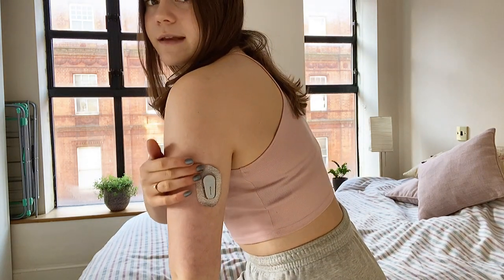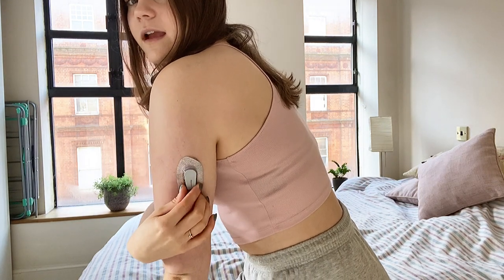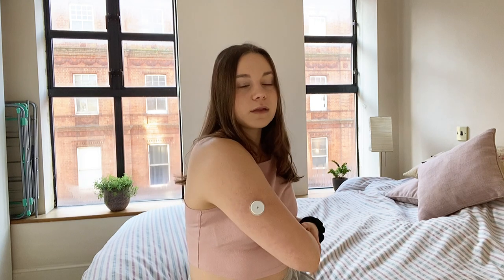One thing to note is that the Dexcom does look slightly more medical — you've got the whole device plus tape, and it sticks out a tiny bit more; the actual site is bigger compared to the Libre, which is smaller and in my opinion doesn't look as medical. Personally I don't care what my devices look like — I just want them to help me manage my diabetes — but I know people can be conscious about showing their devices, so the Dexcom does stand out a bit more.